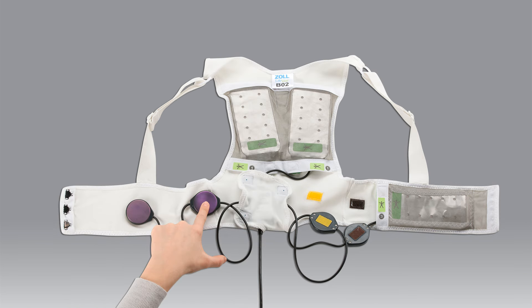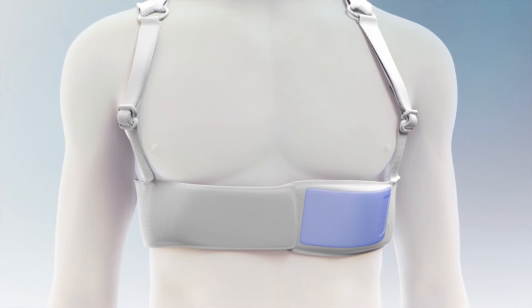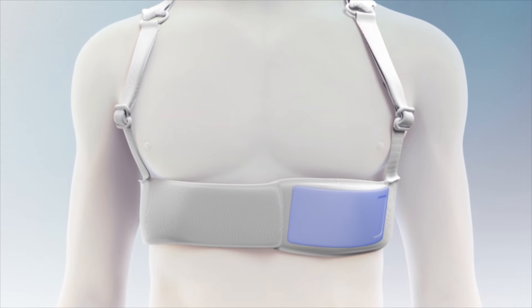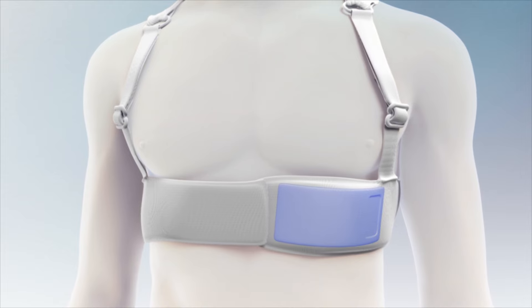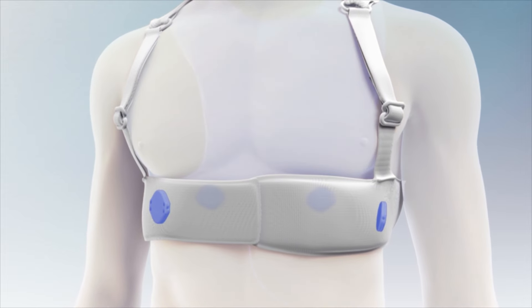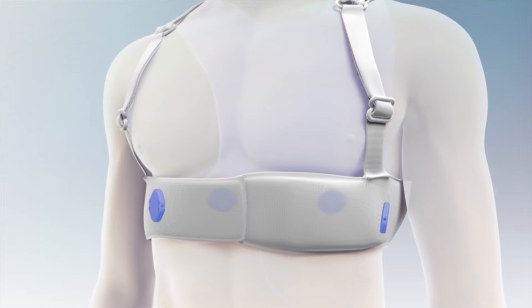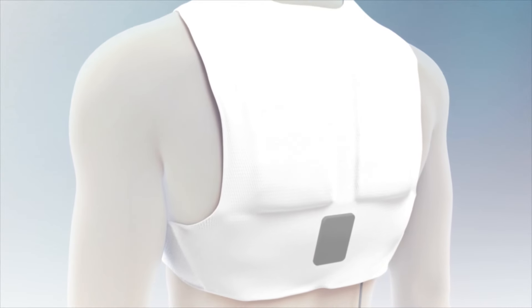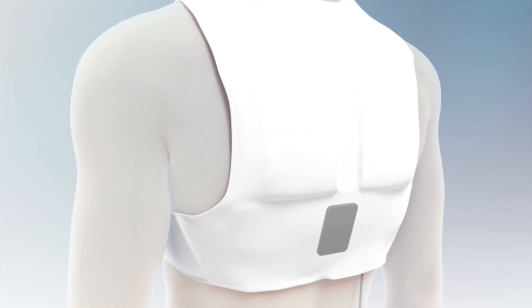This is what your assembled electrode belt and garment should look like. Now that you have attached the electrode belt to the garment, you are ready to put on the garment. In order to work correctly, the Life Vest therapy pads and electrodes must be against the body. The silver mesh of the garment must be pressing against your bare skin. So, before you put the Life Vest on, remove all clothing from your upper body.